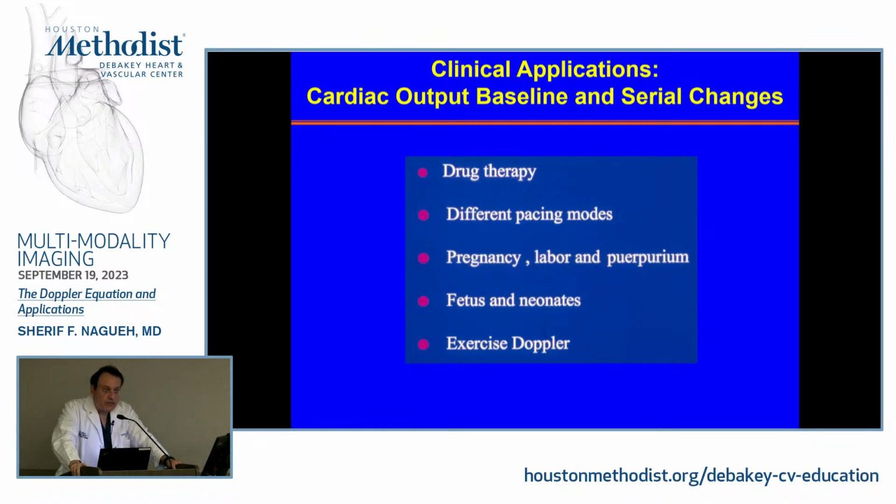The application of Doppler echocardiography to quantify flow has been applied to look at drug therapy. For example, someone in heart failure who is placed on inotropic drugs to improve their cardiac output.